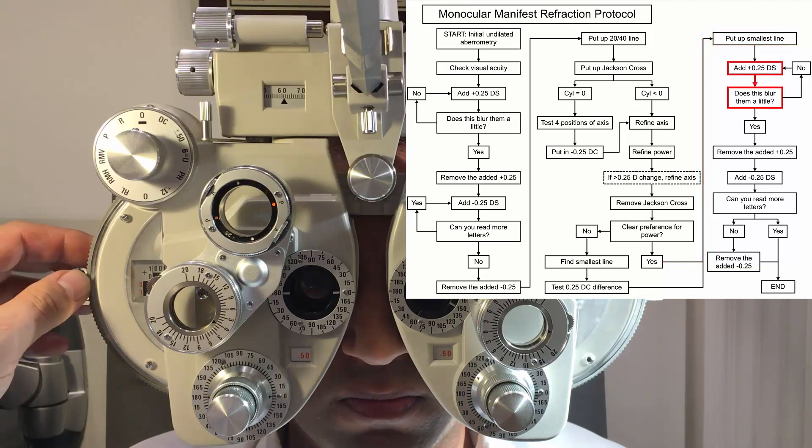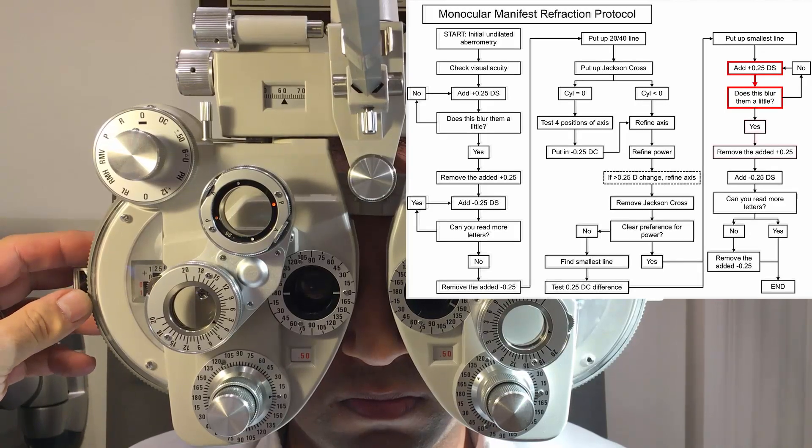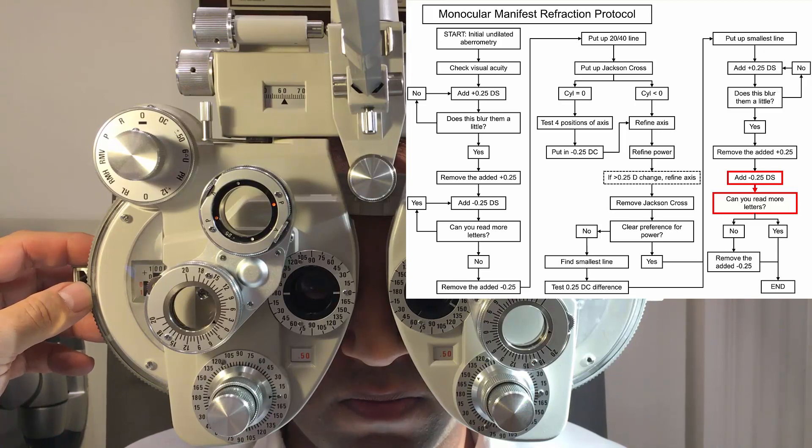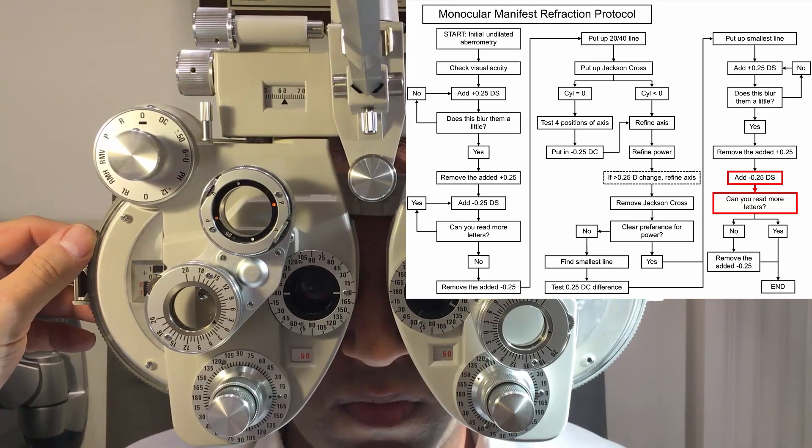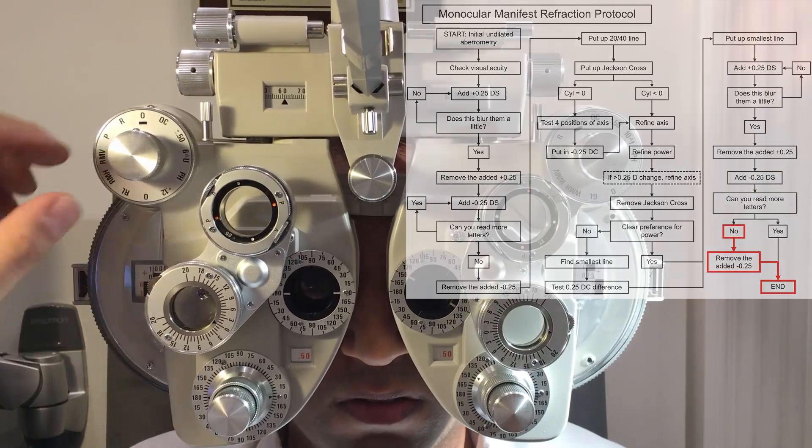Does it blur that H line if I go to there? Yes, it does. So any more on that H line if I go from one to two? The same? Yeah, it's the same, really. Two, pretty much the same. Good, super. Excellent.